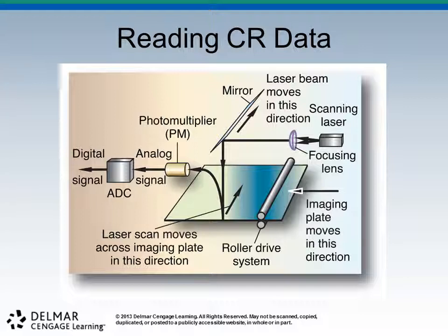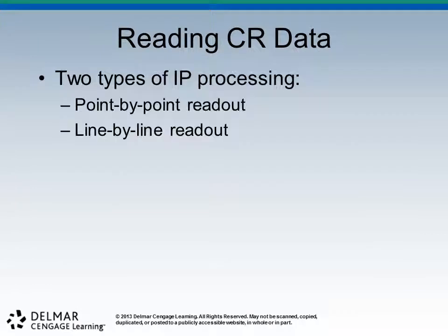So liken this a bit to the automatic film processor, and you'll see there are some major differences and some similarities. We've got a film plate. Or not a film plate, but an image plate. We've got a roller system. But there's much more light going on in here. Of course, film processors are all nice and dark and full of wet chemicals. You're not going to find wet chemicals in here. Or at least I hope not.